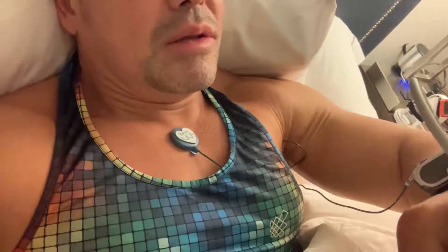This sensor also measures the peripheral arterial tone. If a patient has an apneic event, they get a sympathetic reaction where their blood pressure goes up and blood to the finger is cut off, so the sensor picks up that there's less blood flow. It also picks up pulse oximetry, which is the oxygen in the blood.